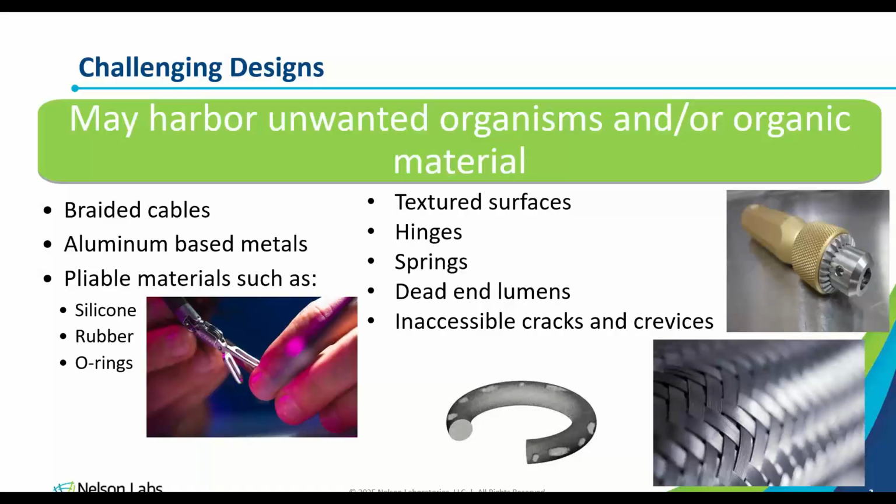So if your handheld instrument is able to be disassembled so that those ball bearings can be more easily reached and are more accessible to the rinsing and to the detergent and even to brushing if possible, then that will greatly increase your chances of passing the validation, as well as having a safe device that's being properly reprocessed in the sterile processing departments.